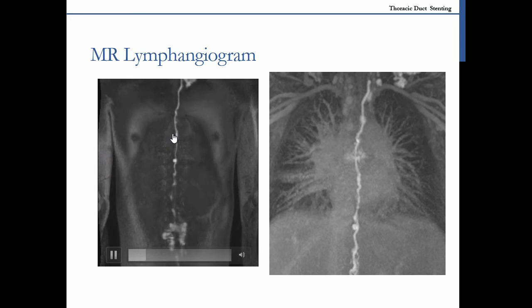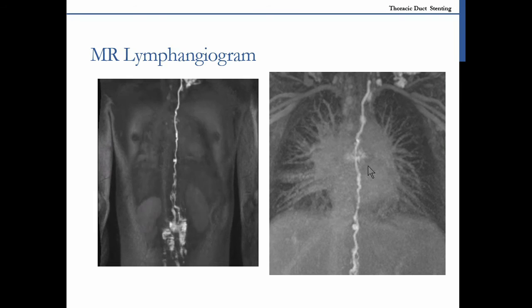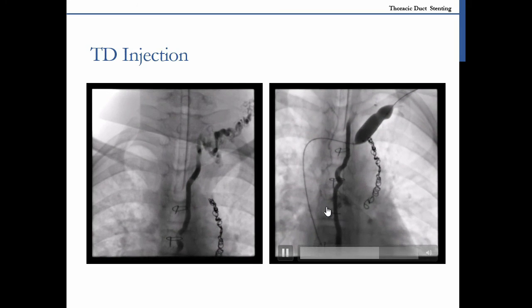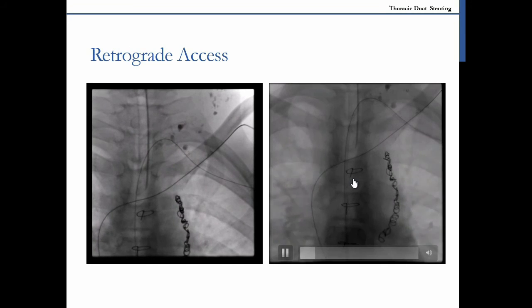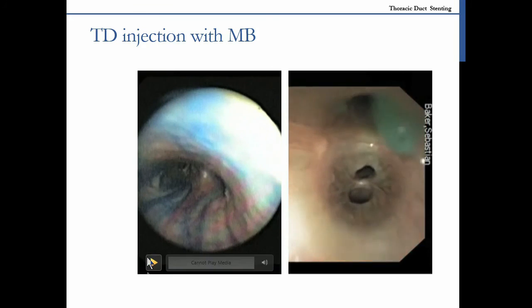Remember, he came from Austria to us, I guess, with all his family and friends and physician, and suddenly we actually don't see that much perfusion on MRI, and we get scared. So maybe we brought him for no reason. But when you occlude the thoracic duct with a balloon and inject, you actually can see the perfusion getting better and better, bigger and bigger.